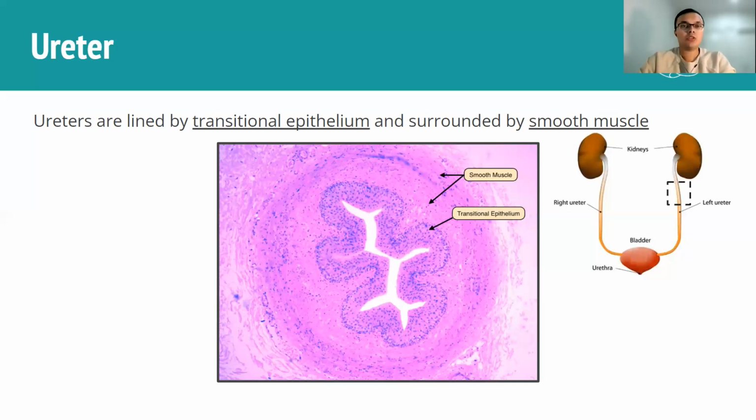The next important thing you have to know about the ureters is that they're surrounded by a layer of smooth muscle. You can make it out here on the outside, this pinkish histological stain. That muscular layer allows the ureters to undergo peristalsis, which is important because it allows them to propel the urine forward, especially if you have obstacles in the way. It can allow it to squeeze past that obstacle and even clear small stones and small obstructions as well.